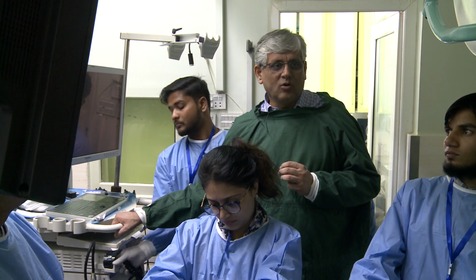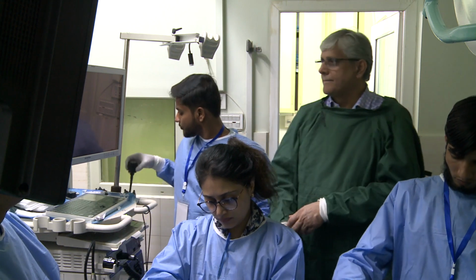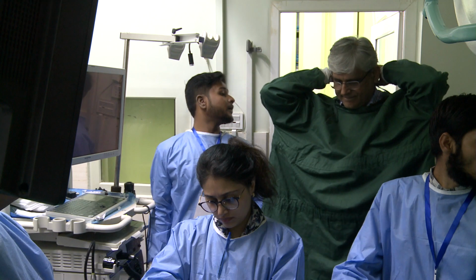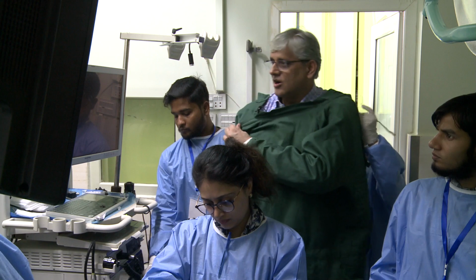Would you add anything more or what? I think you have given a very comprehensive, nice report. Okay, so good news is that I finally got a patient who has got abdominal pain.